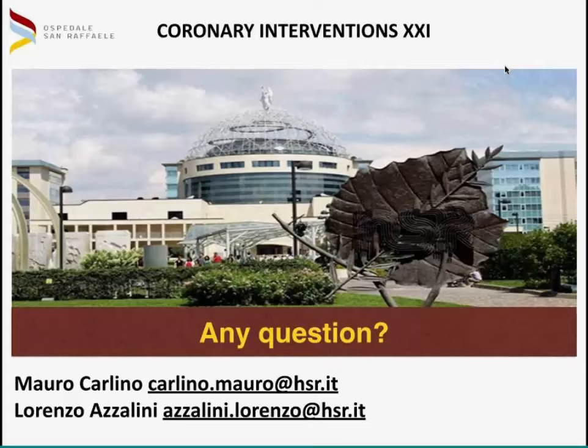And I must say I do like the freedom you have when you externalize, because you can't lose your wire. You have great support, especially through septals. Now, epicardial is a very small and tortuous vessel. I can see the problem there. If you get too much tension on the heart, you might injure the collateral. But otherwise, I do prefer the externalization, just as you said, Mauro.